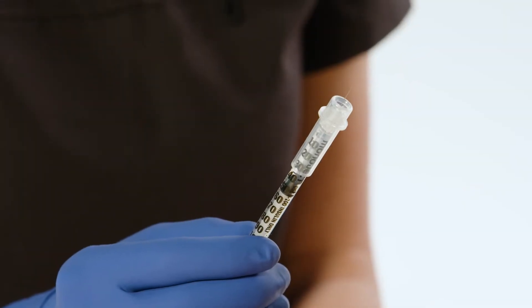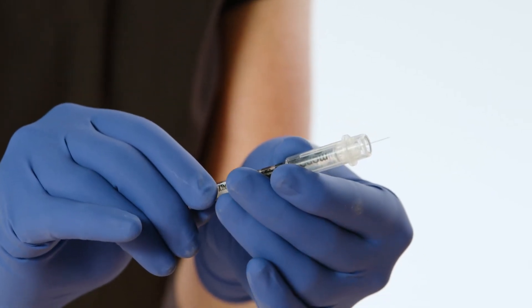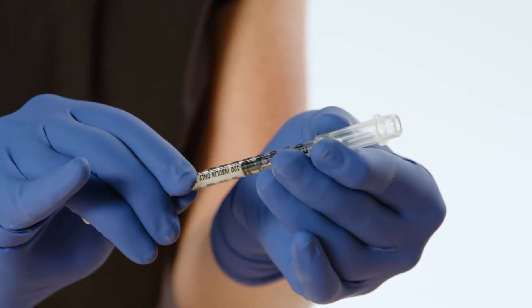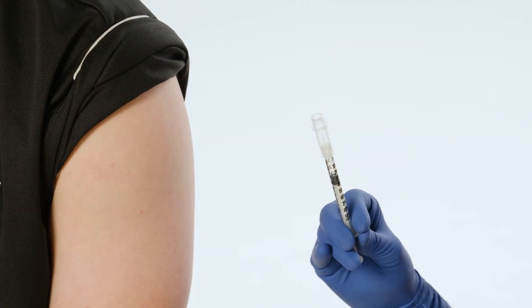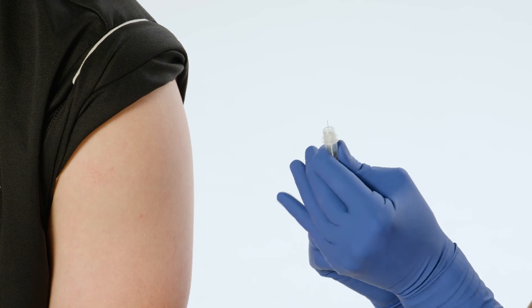For transport mode, keep your fingers behind the widest portion of the shield and fully extend the shield over the needle until you hear and feel a click. In transport mode, the needle is protected but the syringe is not permanently locked. Once ready to give the injection, slide the shield back to its original position, exposing the needle.